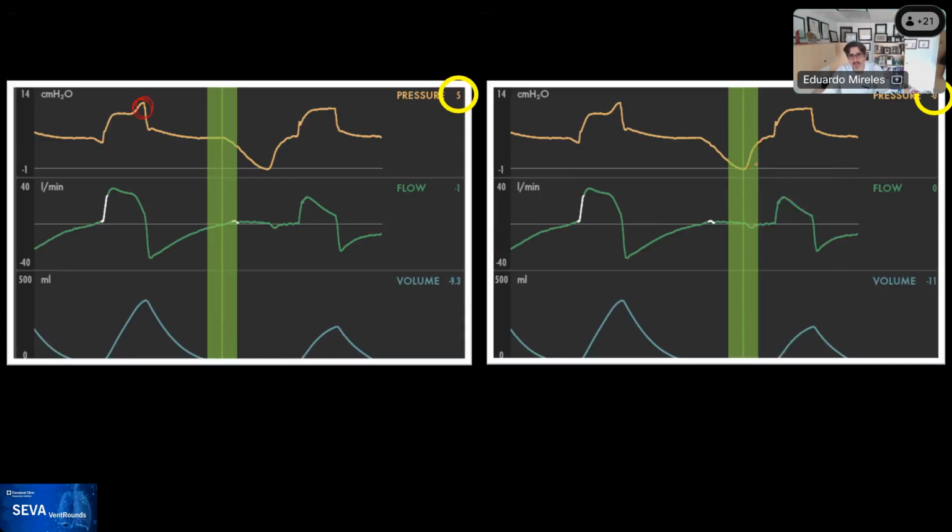Yeah, because they're trying to relax and they can't exhale. And if we were on NAVA, it actually uses 70%, so it would end up around here. Yep. So probably closer to what I was doing over here, right? Yep, exactly. That's what I was thinking. Right.